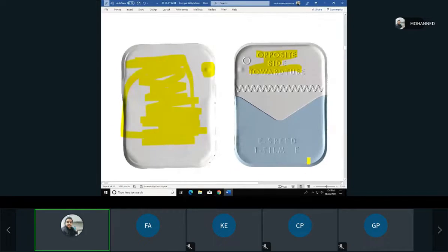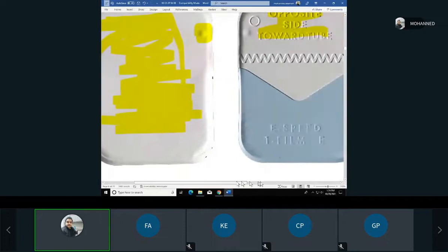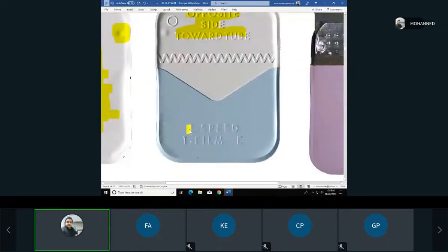And here, what is the speed? E, yes. Not so fast, but still, not the fastest. So usually the speed is written also on the back of the X-ray film, so you know what it is.